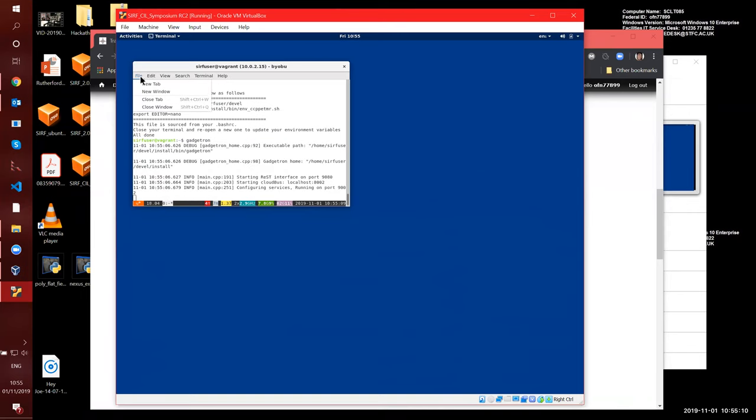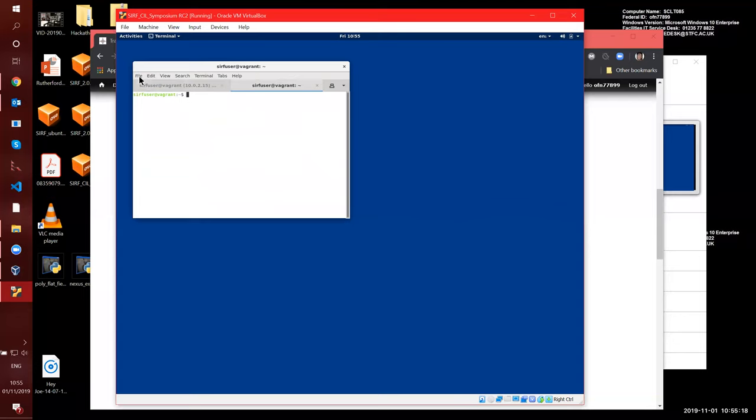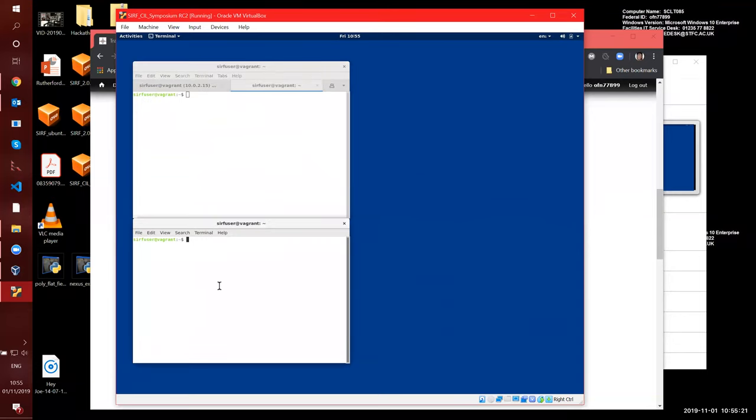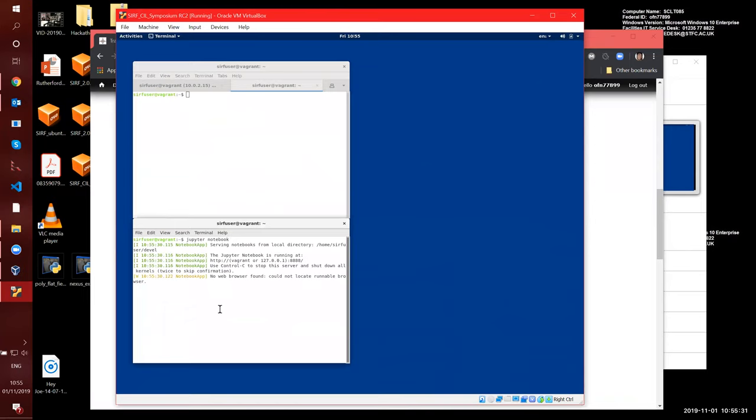And then you have to start the Jupyter Notebook, which you may do in a different tab here, or in a new window here, doesn't matter. And it starts by Jupyter Notebook. Now you see it has a warning saying no browser was found, and this is because we suggest you to use a browser in the host machine rather than in this machine.